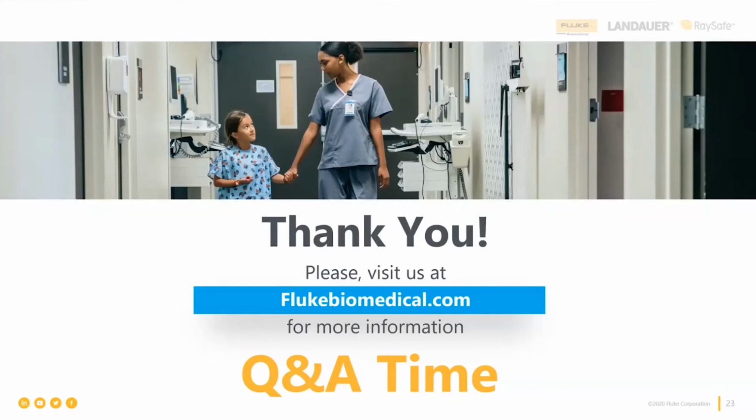And so it is a capacitive coupled current flow, but we need to know how much is there and how it changes given a couple of different single faults. So you're going to use aluminum foil, and yes, it can be done, and no, you can't avoid it. Next question. That's a good answer, Jerry, because this is the one thing after 20 years in the field, as soon as I joined the Fluke team, that I learned the hard way. Caught me off guard on it too.